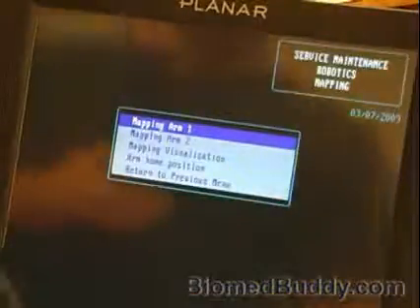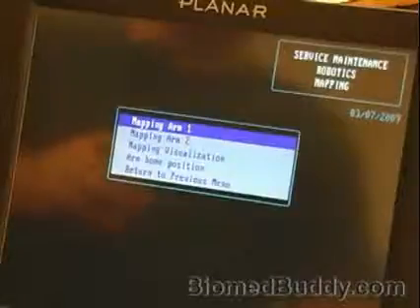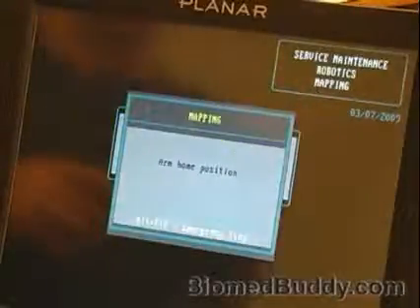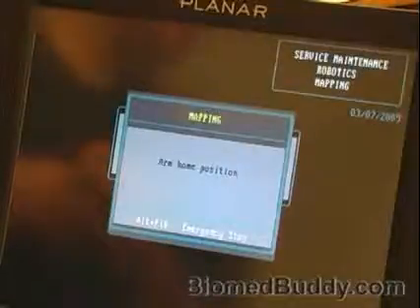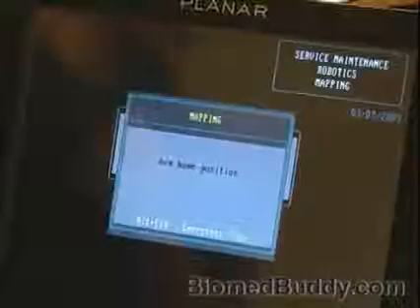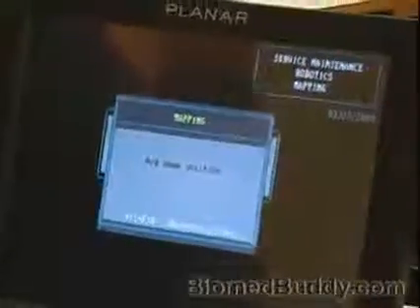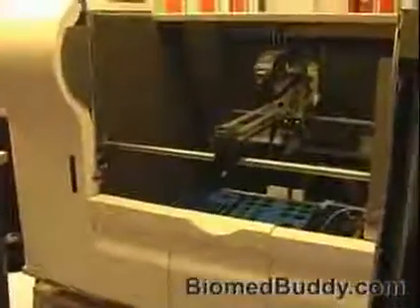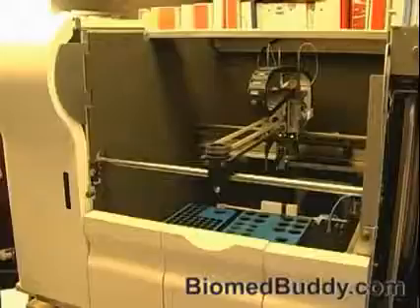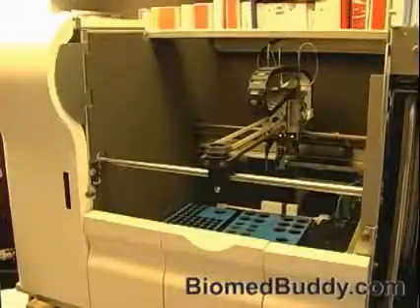We're going to map arm number 1. Not much to arm number 2. In fact, I can say that generally, for the most part, you never have to map number 2 because it's a stationary arm. There's very little that can go wrong with it, or if something does go wrong, you should ask yourself why, because for the most part you should never have to map number 2 unless you've changed some component, like maybe the back motor.